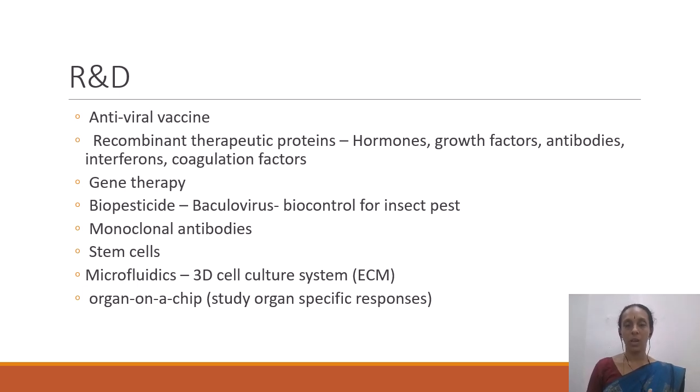They are growing, but to form a monolayer, the cells just growing is not enough. There needs to be some kind of extracellular matrix, that is a protein complex, produced such that these cells form a layer. They are attached or stuck to one another in such a way that there is some form of communication between the cells, toxin removal, and a two-dimensional structure that is being built. In the cell culture technique, as of now, only two-dimensional is seen.